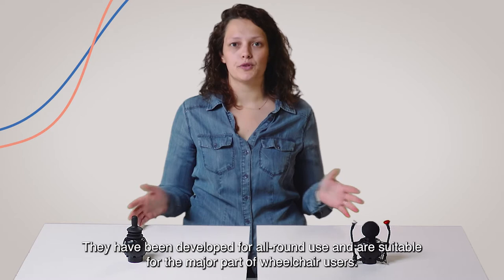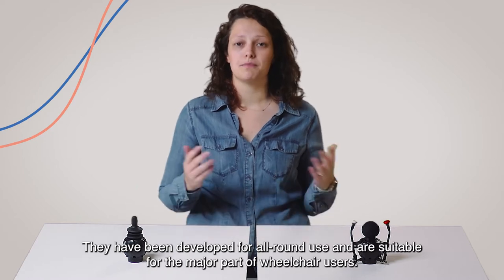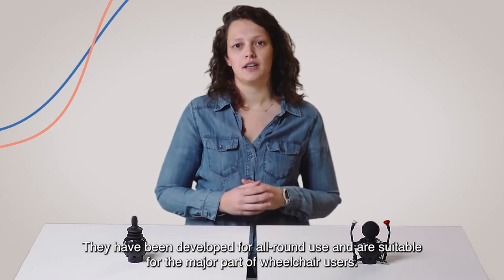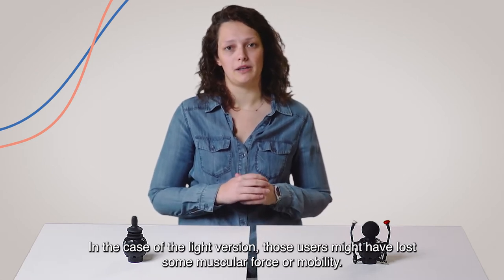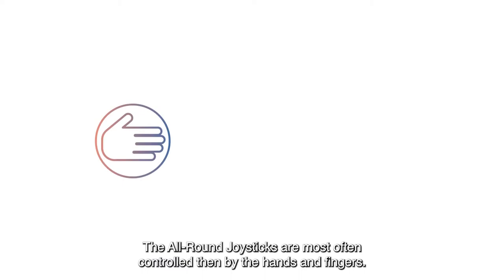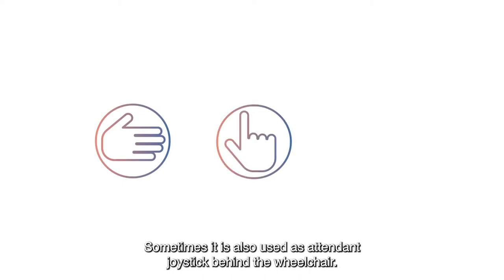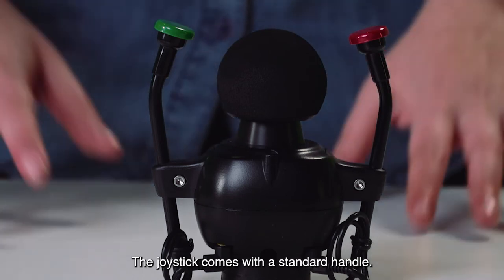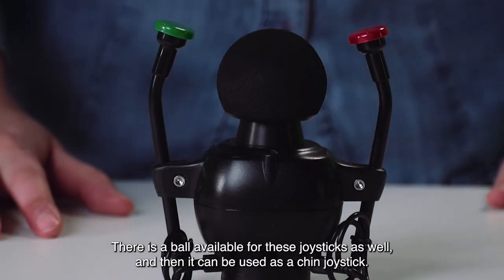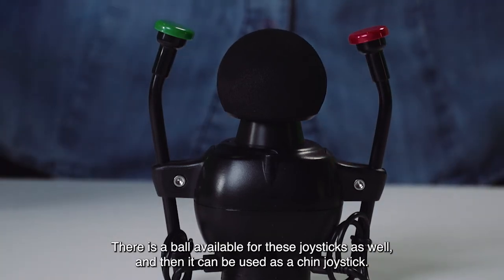They have been developed for all-round use and are suitable for the major part of wheelchair users. In the case of the light version, those users might have lost some muscular force or mobility. The all-round joysticks are most often controlled by the hands and fingers. Sometimes it is also used as attendant joystick behind the wheelchair. The joystick comes with a standard handle, and a ball is also available, allowing it to be used as a chin joystick.